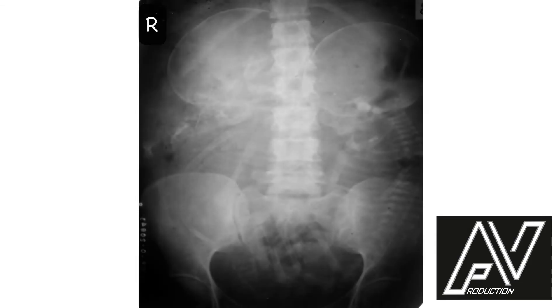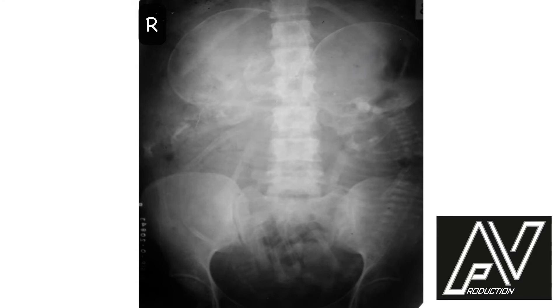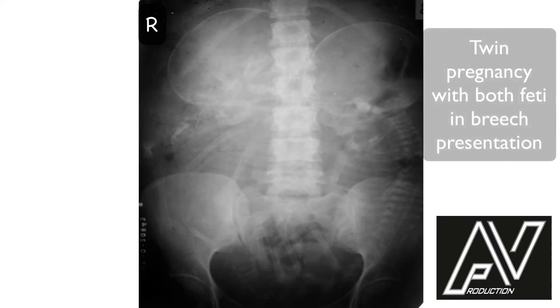This is a plain x-ray of the abdomen and pelvis, AP view, well centralized, well exposed, showing two fetuses. The fetus on the right side is in longitudinal lie, flexed attitude with complete breech presentation, and the fetus on the left side is also in longitudinal lie, flexed attitude, complete breech presentation. Heads of both fetuses are well flexed. There is no discordancy in fetal size. The twins are lying front to back and therefore cannot be conjoined twins. There are no obvious fetal skeletal defects. Therefore, my diagnosis is twins, both in longitudinal lie with breech presentation.